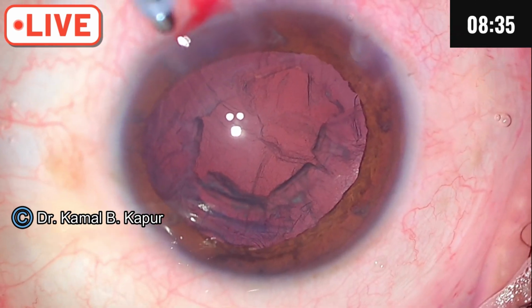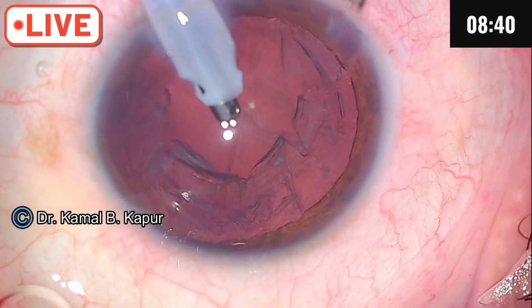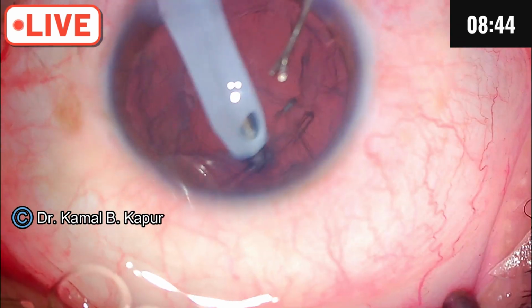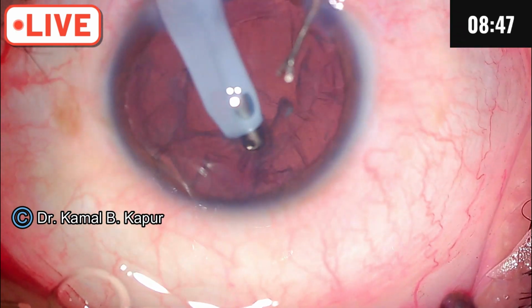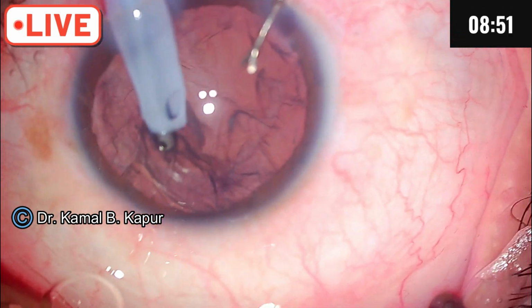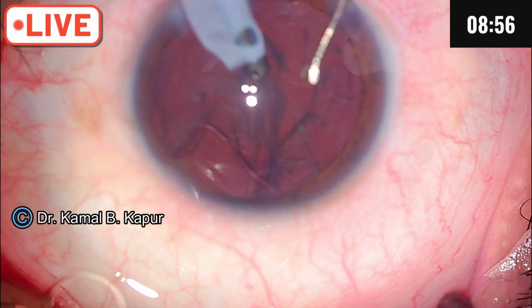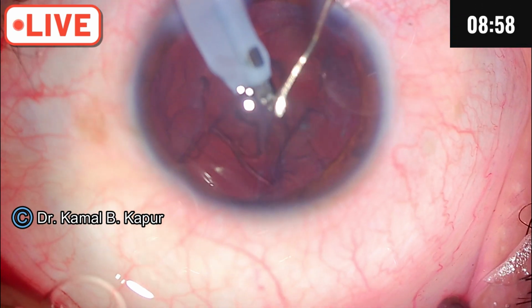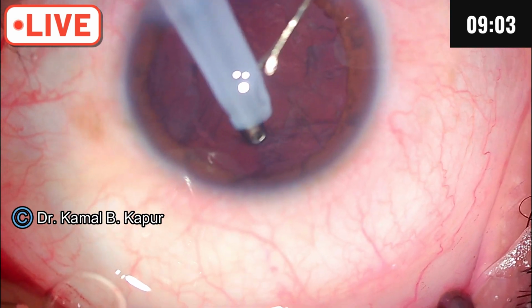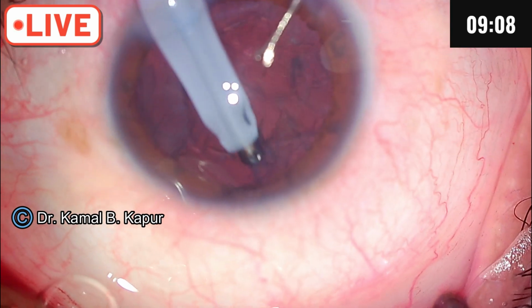Now the next part of the trick is removing the cortex from behind the CTR or the ECR. So we have to do a tangential peeling, never a radial peeling. No movement like this. We have to go side to side because we might break some remaining zonules. So again you will notice a tangential movement of the zonule of the cortex removal.